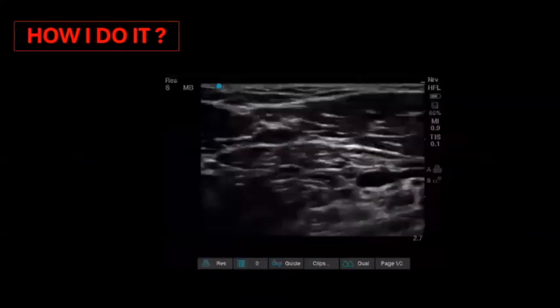The patient is properly positioned and optimized. Then before going for the final procedure, a cord scan is to be done, and all three cords of the plexus have to be identified. We advocate a multiple injection. So look at how we proceed for the block.